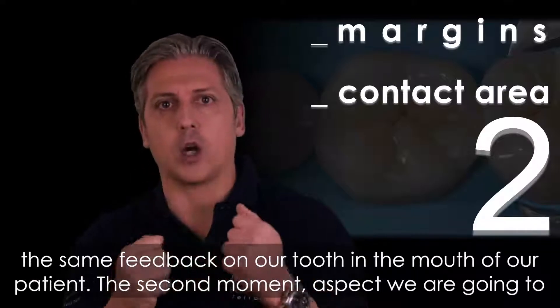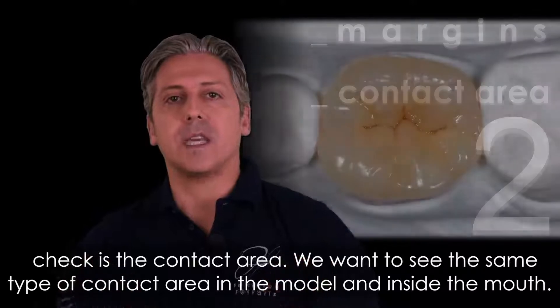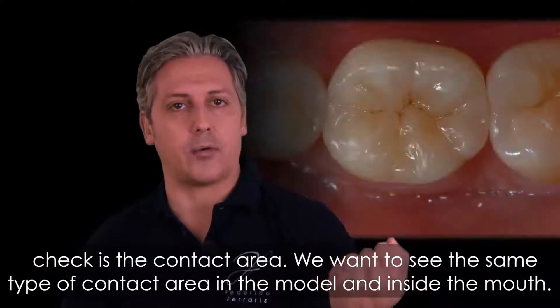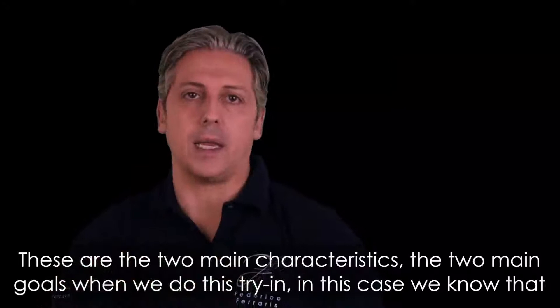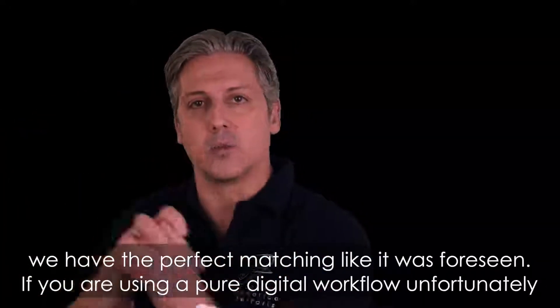The second aspect to check is the contact area. We want to see the same type of contact area on the model and inside the mouth. These are the two main characteristics and the two main goals when we do this try-in. In this case, we know that we have perfect matching as foreseen.